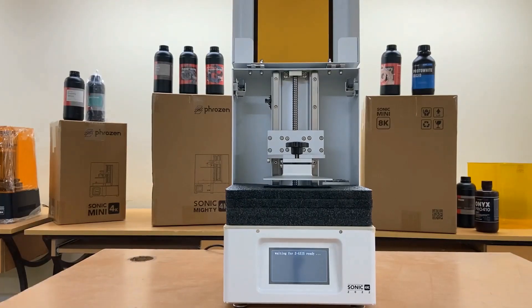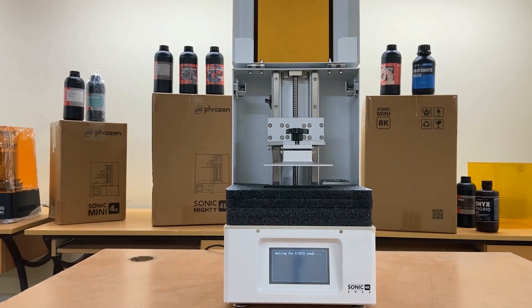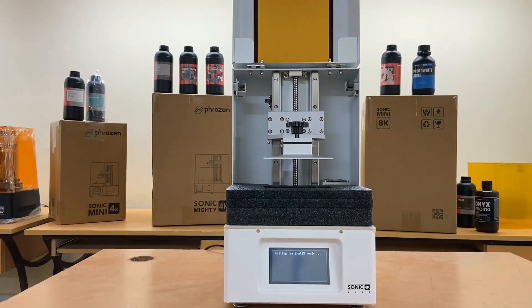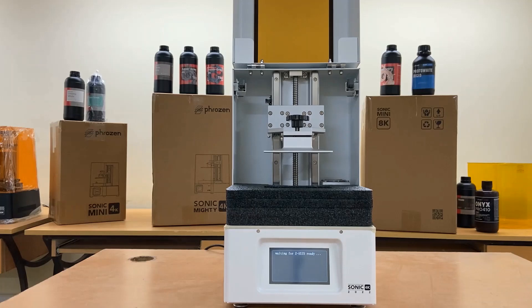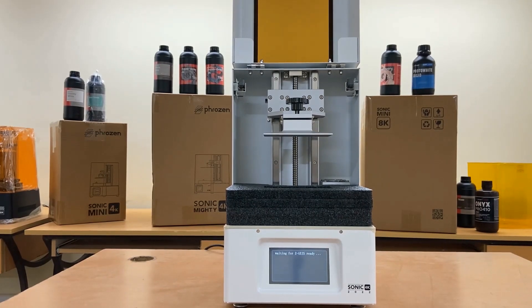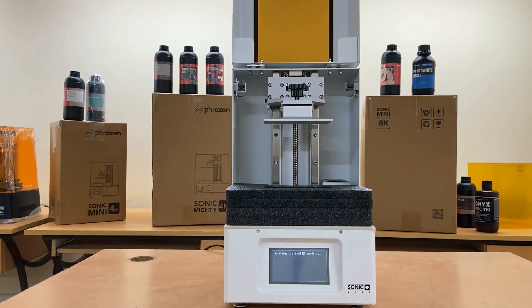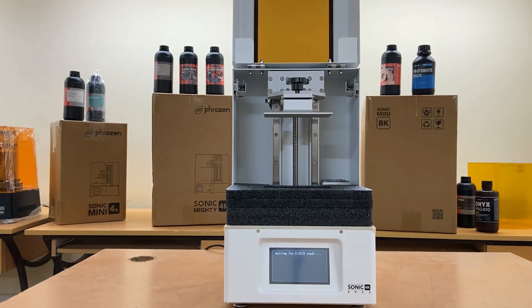Specifically designed for dental professionals, the Sonic 4K 2022 comes with a spacious building plate and is capable of printing large amounts of precise dental models at 4K resolution. It also comes with Phrozen Dental Synergy slicer software and an easy-to-use interface.